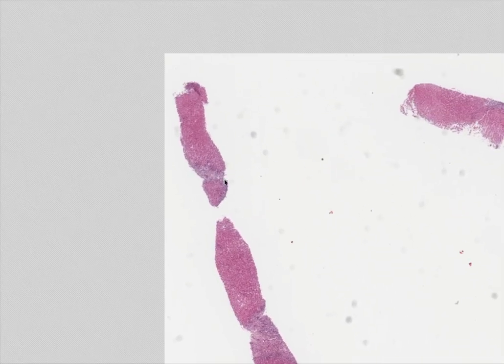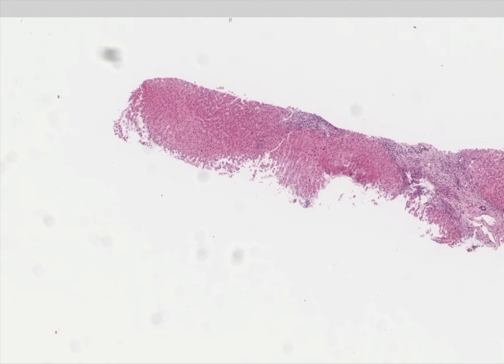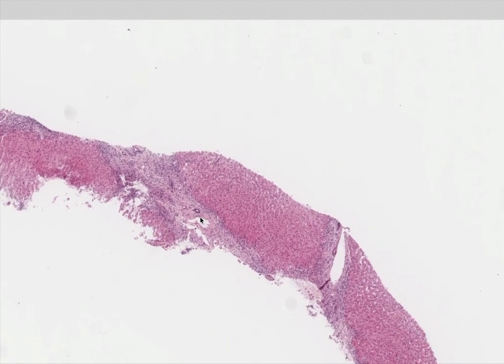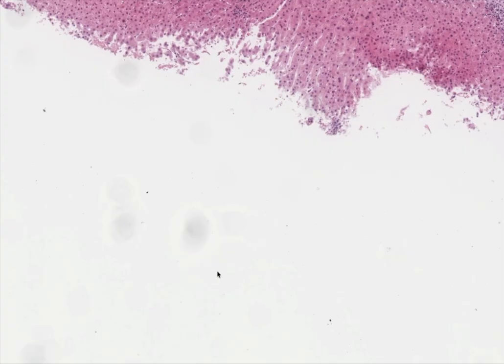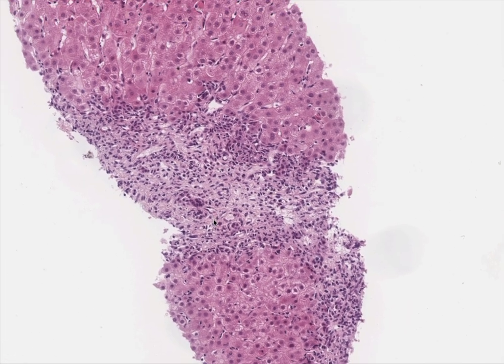There's a long break here where the portal tract kind of runs around here, maybe forming an early nodule. So I'm thinking that the architecture, which again we can see here with maybe an early nodule and here, shows bridging fibrosis. So what's causing this bridging fibrosis? Let's have a look at this portal tract.